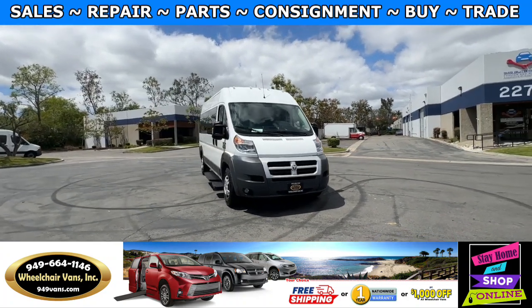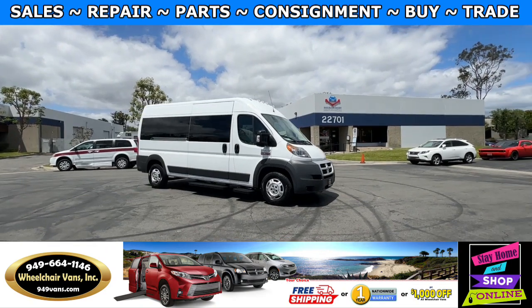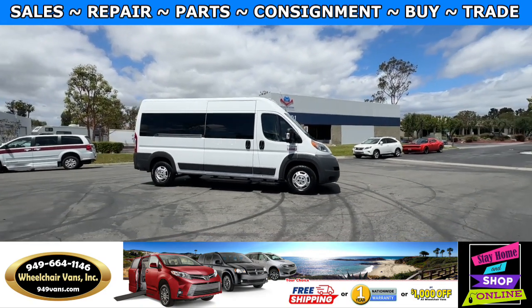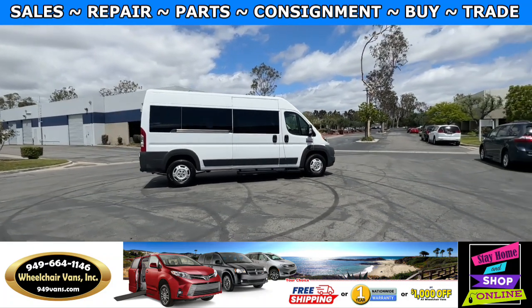Hello and welcome to Wheelchair Vans Inc. Today I'll be going over a 2015 Ram Promaster 2500 equipped with the BraunAbility rear lift.